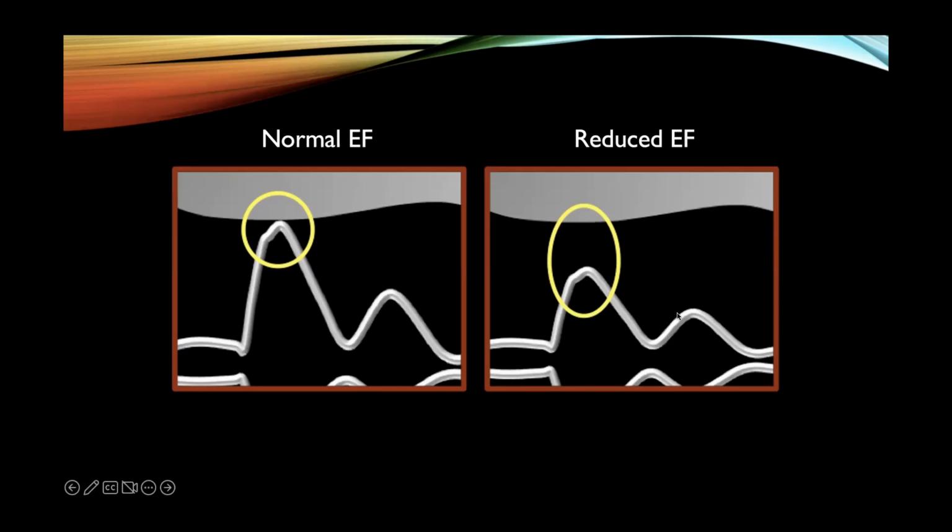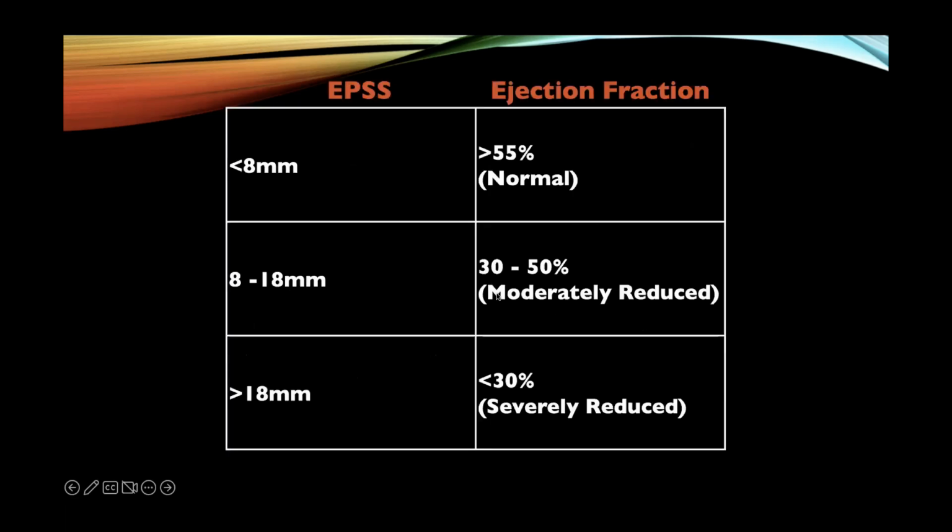Chris, we expect it to touch the mitral wall. Or the mitral wall, sorry, the septal wall. Yes, the interventricular septum, perfect. So that's what we're measuring. On the left side, you can see how the anterior leaflet of the mitral valve is basically touching the interventricular septum, and on the right side, it's not. So we're concerned for decreased EF.